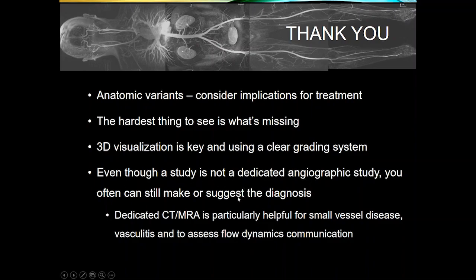And so again, even though the study may not be a dedicated angiographic study, you often can still make a diagnosis or suggest a diagnosis and then recommend dedicated imaging, which is particularly helpful when you have small vessels or vasculitis, or you need to see the flow dynamics or some kind of communication that you really want to differentiate between high flow and low flow states.